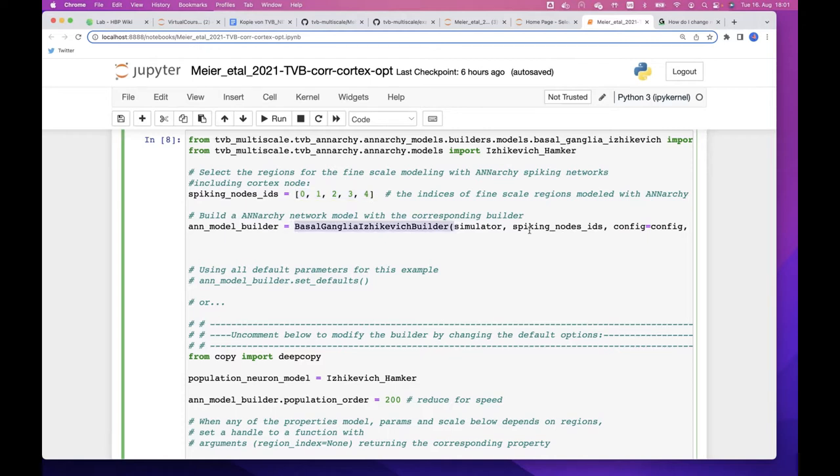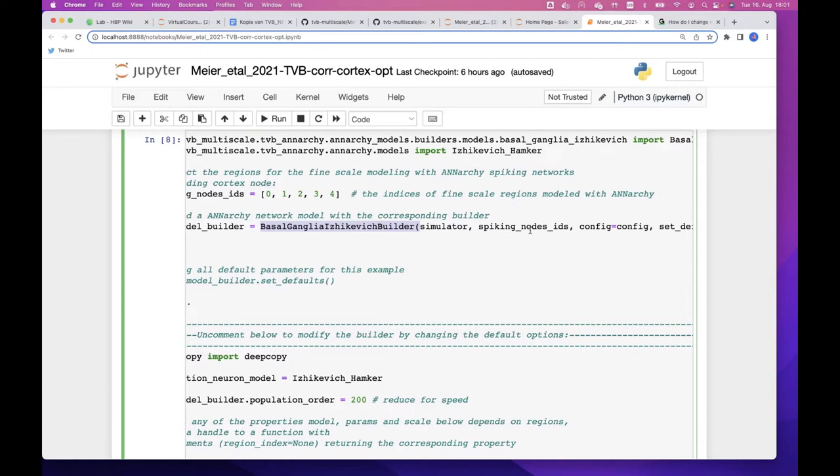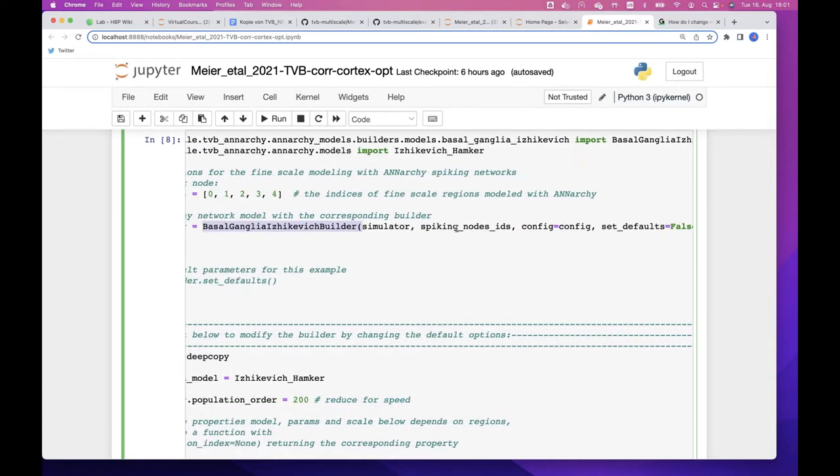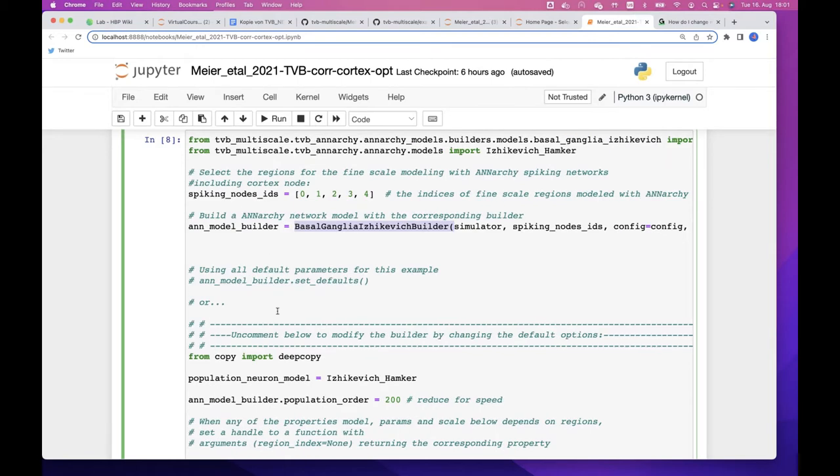All right, so the connectome used eventually for simulations looks a little bit different, because we wanted to adjust these basal ganglia weights with the rest, just for visualization purposes, so that they are quite similar.